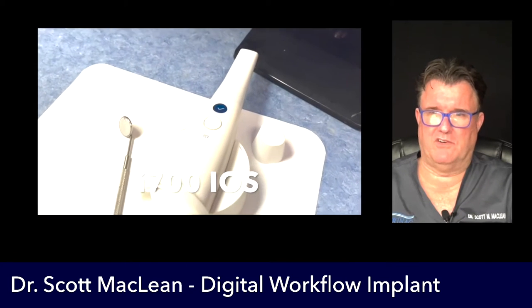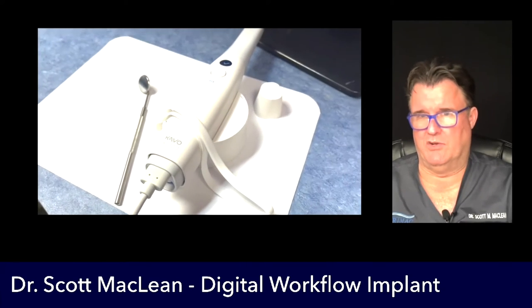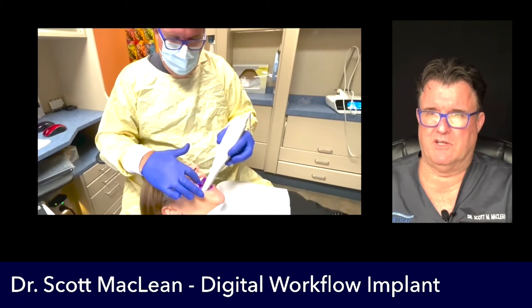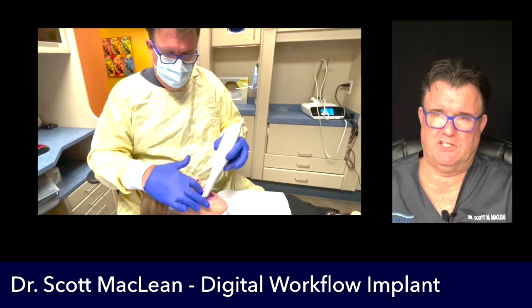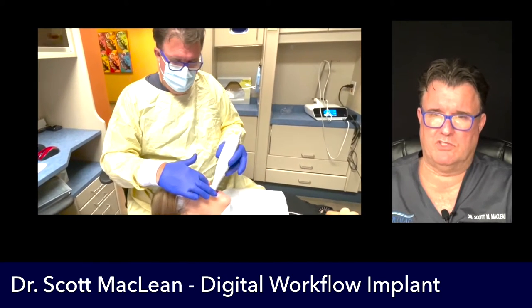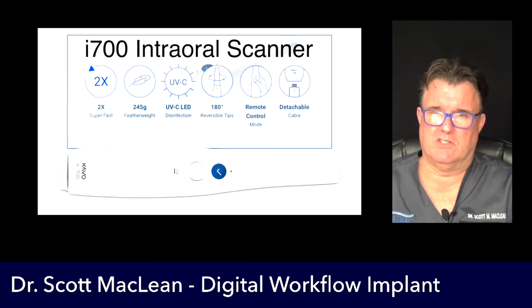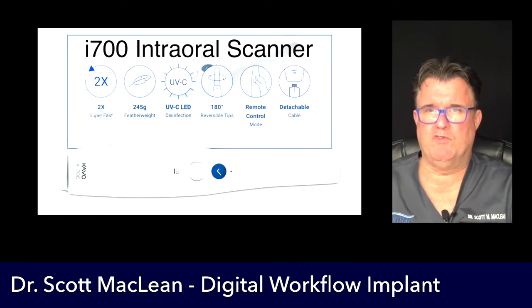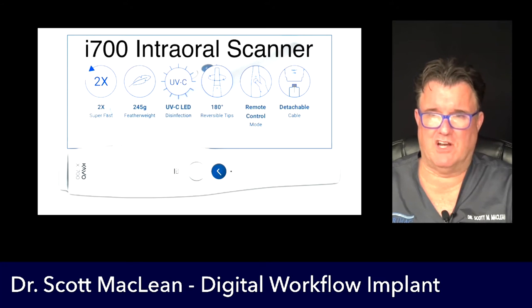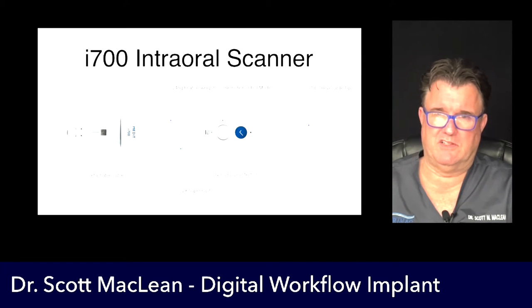Let's have a look at the scanner. It's the i700 intraoral scanner and we're going to be doing some implants on a patient. You start the scan and this scanner has features like a detachable cord, small buttons that are easy to use — on/off buttons and rotational buttons on the back. The scanner itself is super fast — twice the speed of its predecessor, the i500. It's featherlight, has a UV LED light on the side that's cleaning itself inside all the time, and features an under-180-degree reversible tip.